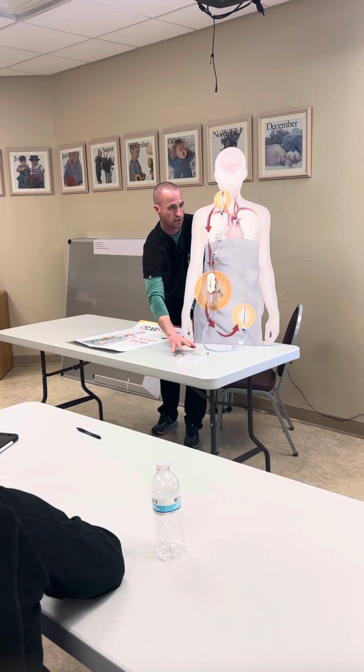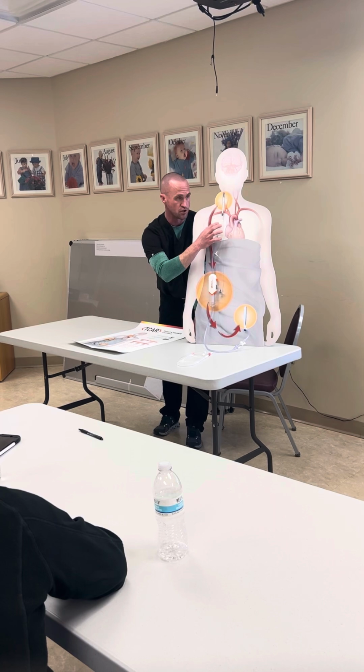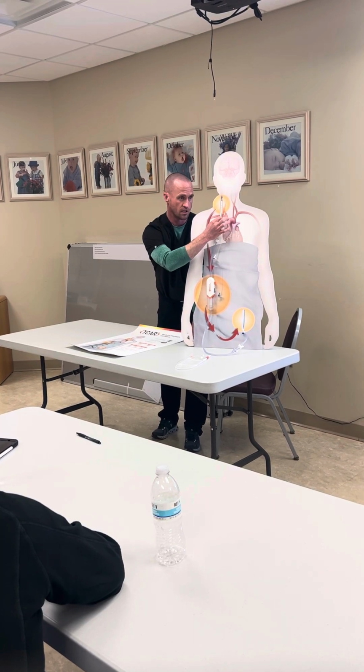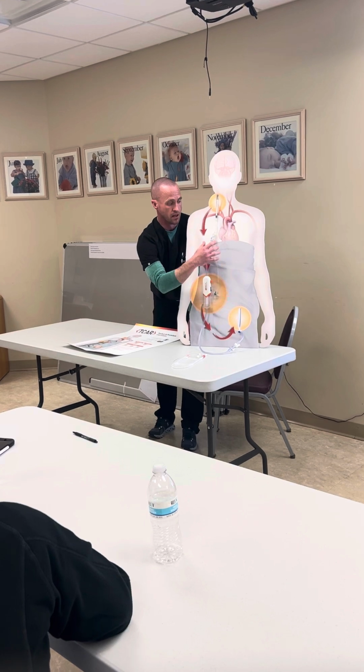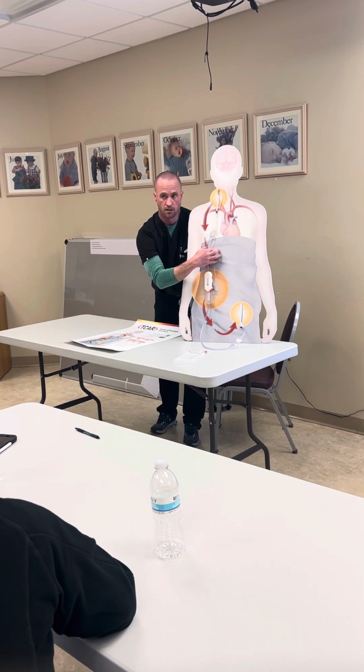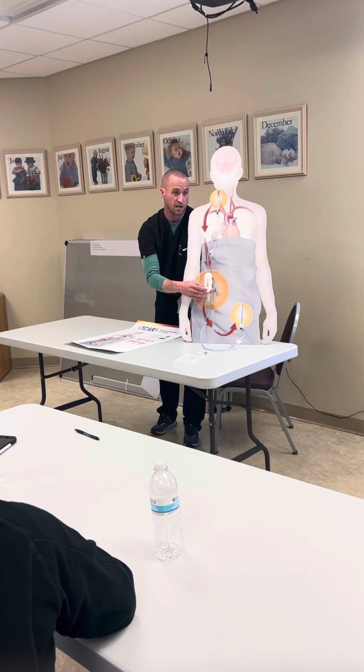We provide our micropuncture kit, we provide the wire that's included in this kit here, and the sheaths. So again, an 8-French sheath in the carotid, we put an 8-French sheath in the femoral vein, and then we connect it with this large bore tubing. And this large bore tubing has a filter in it, and this is basically an out of the body shunt.